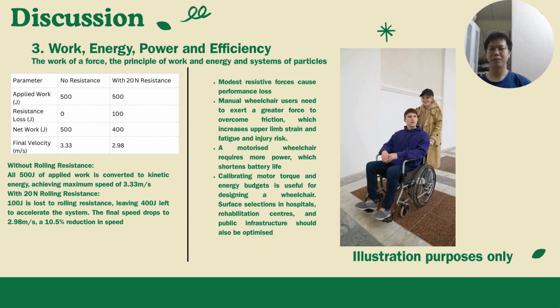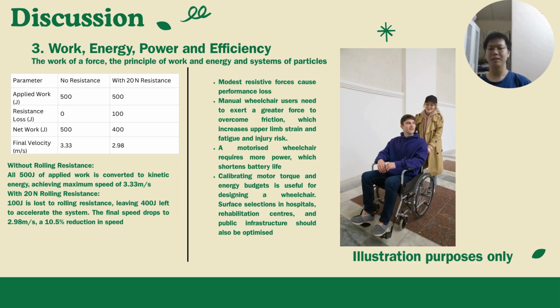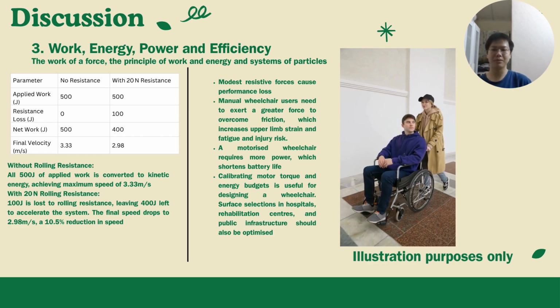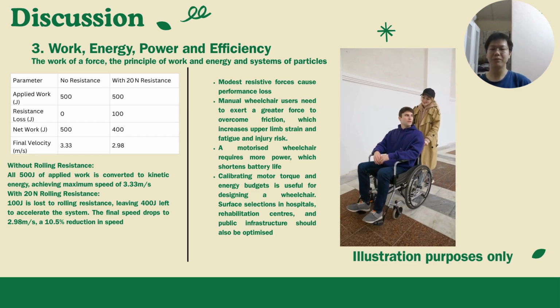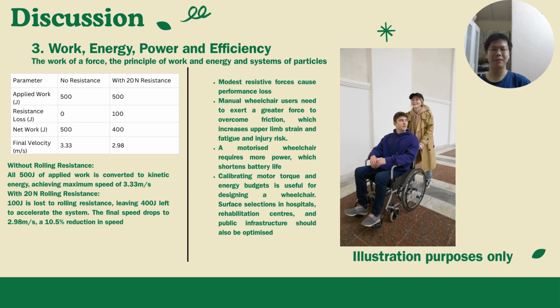This underscores the importance of optimizing motor torque and energy efficiency during wheelchair design, reducing mechanical resistance through better wheels and bearings, and improving rolling surfaces in public facilities to minimize user effort and power demand.